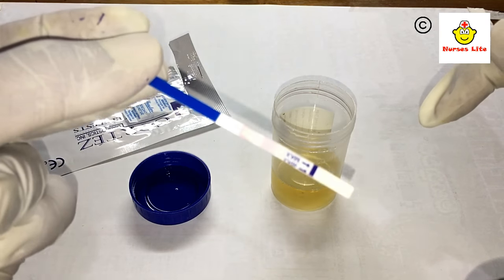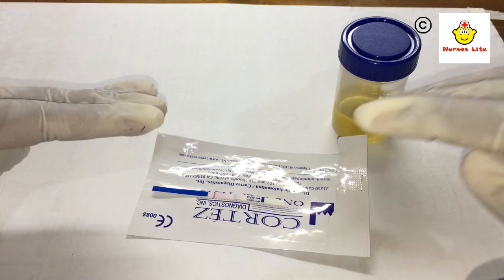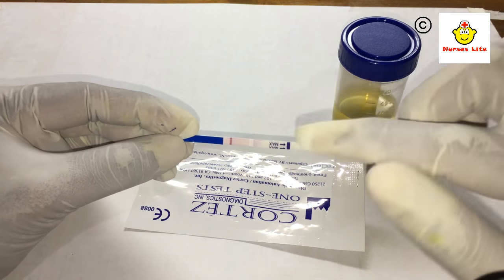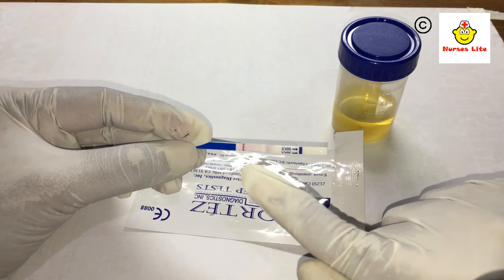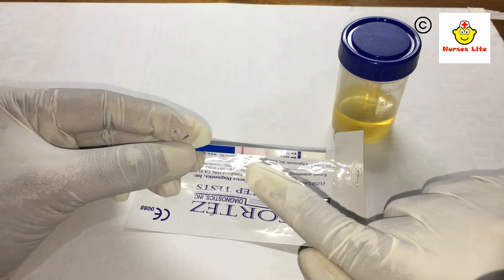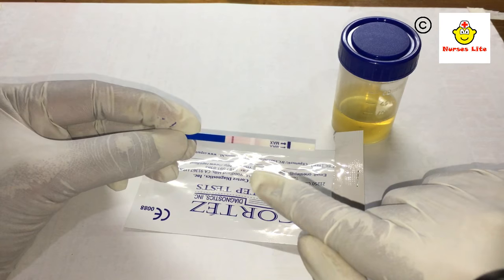You should make sure the strip is placed horizontally on a flat surface. Now you can see a line has appeared — this is the control line. The control line indicates the strip is working fine. If you see another line appearing, that indicates you are pregnant. One line is a negative result.